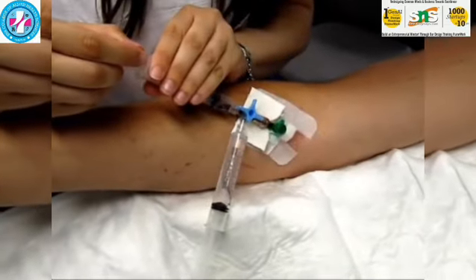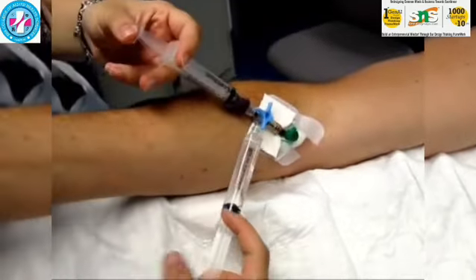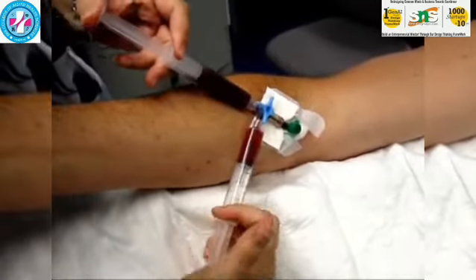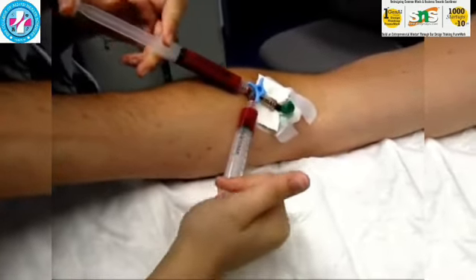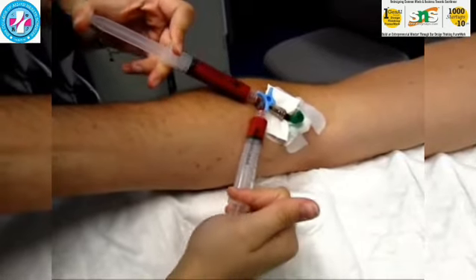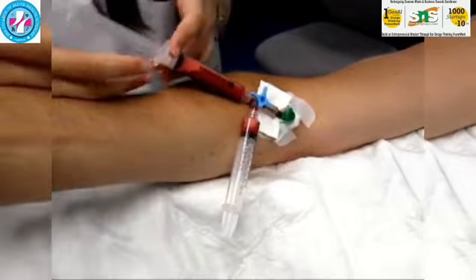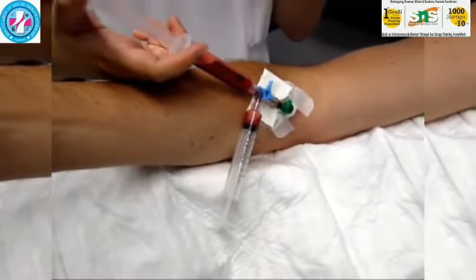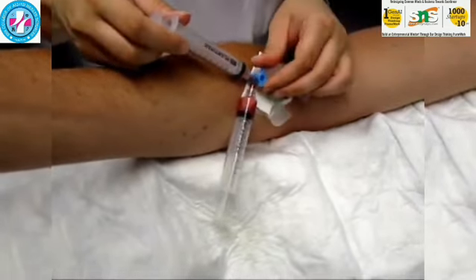In contrast echo, it is helpful to see if there is any tiny hole or problem at the back of your heart. It is usually carried out in people who have suffered a stroke at a young age, where the reason the stroke happened was not found from routine tests. Okay, the salt water is shaken between the 2 syringes, or agitator, in order to create tiny bubbles.